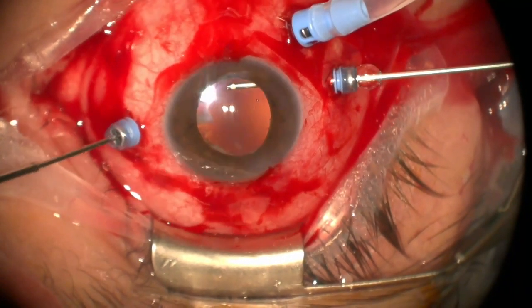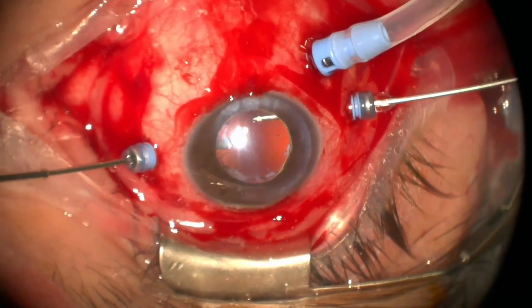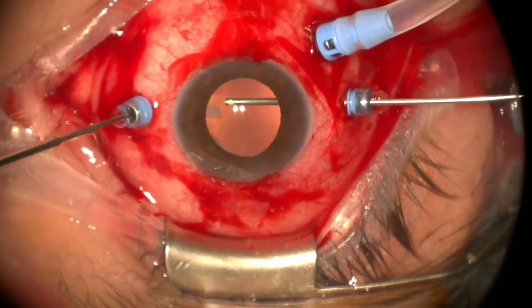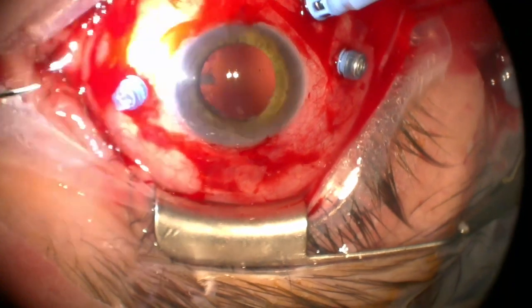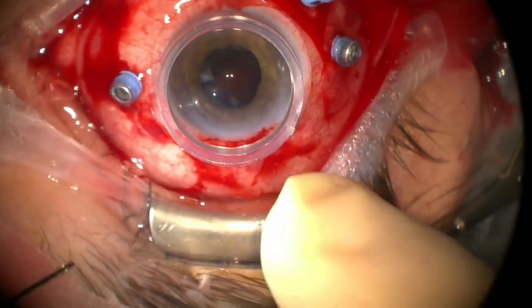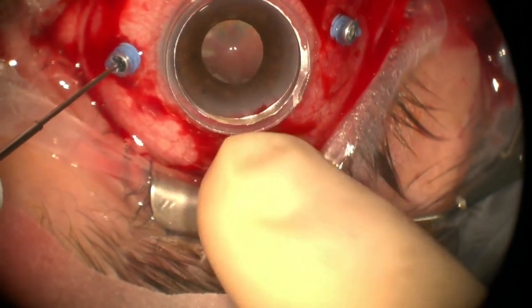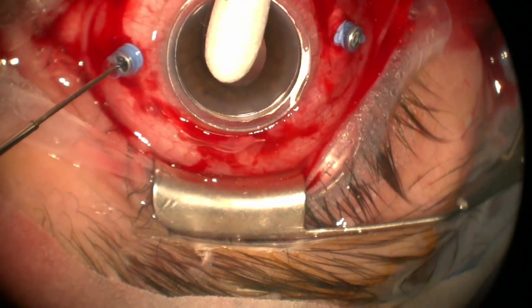There we go. So the capsule's still there. You can see it in all the quadrants. We'll worry about that later. Like I said, it's not the most critical piece. There's always ACE IOLs or sutured IOLs if that was truly not going to hold us.